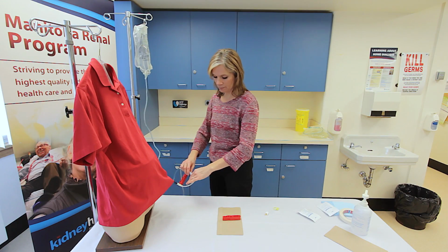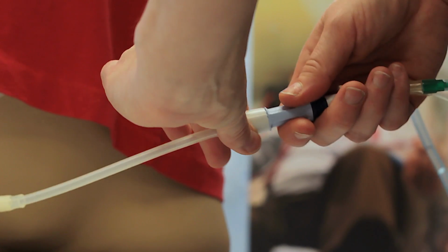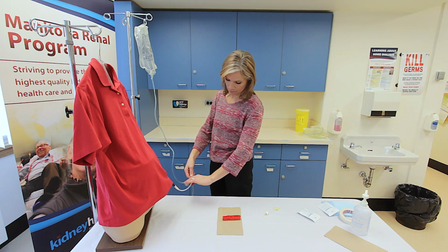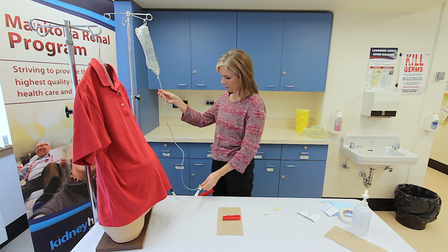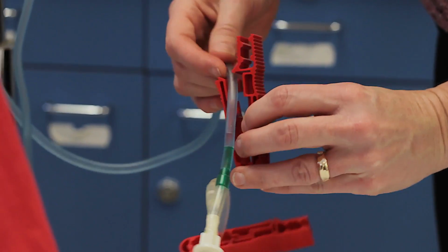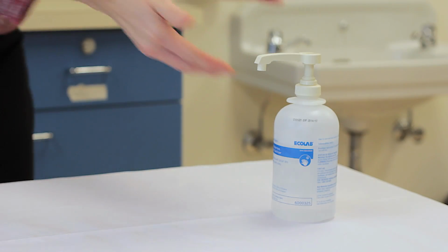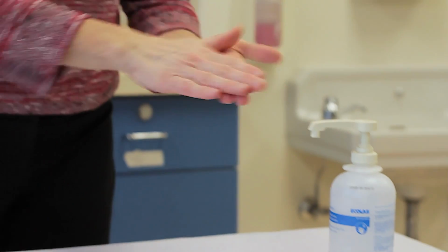Close the transfer set twist clamp when the dialysate solution has completely infused. There will be some air in the fill line, but there is not enough air in the system to reach the peritoneal cavity. Clamp the fill line with a second clean clamp. Perform hand hygiene.